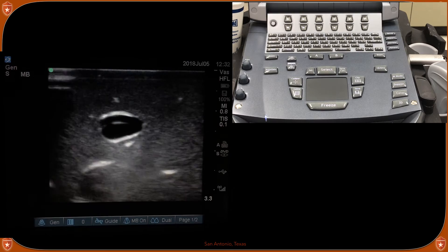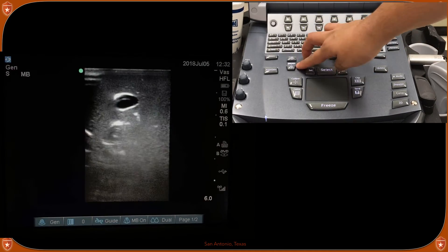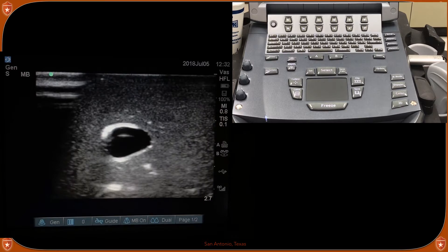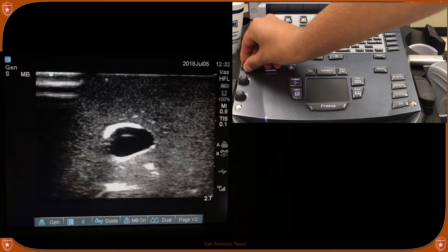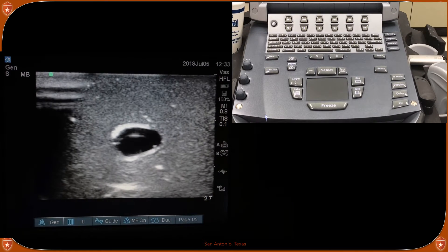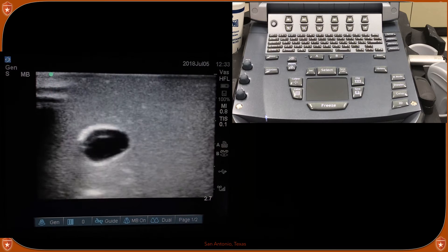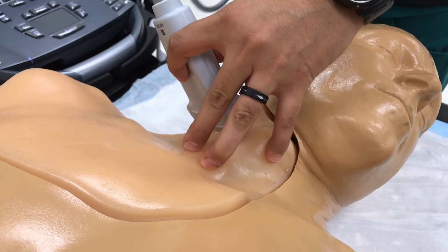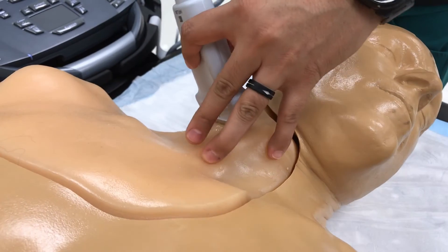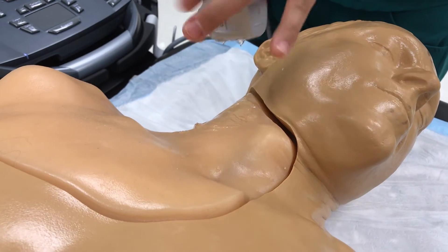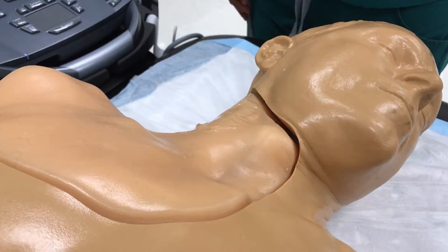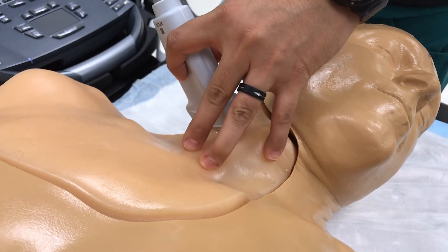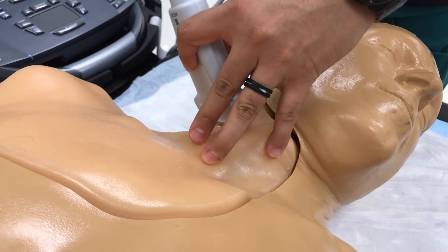Once done, put the ultrasound probe in the area you're going to be scanning and optimize your image. Adjust the depth with the depth buttons to make it more superficial or deeper, and use the time gain compensation knobs to increase gain — you can adjust the overall gain, far field, or near field. Once the image is clear, you are ready to proceed. Always anchor the probe using your pinky, ring finger, and middle finger so the probe doesn't slide off the neck or arm and you lose the vein.